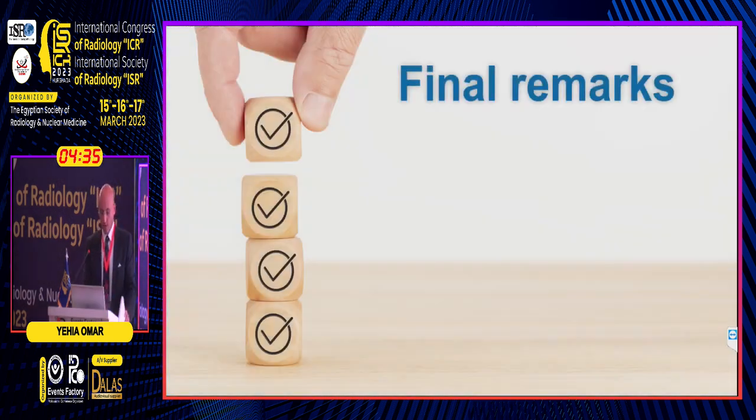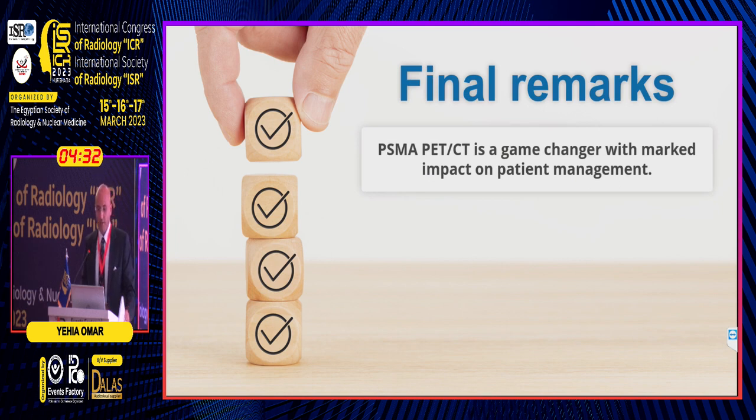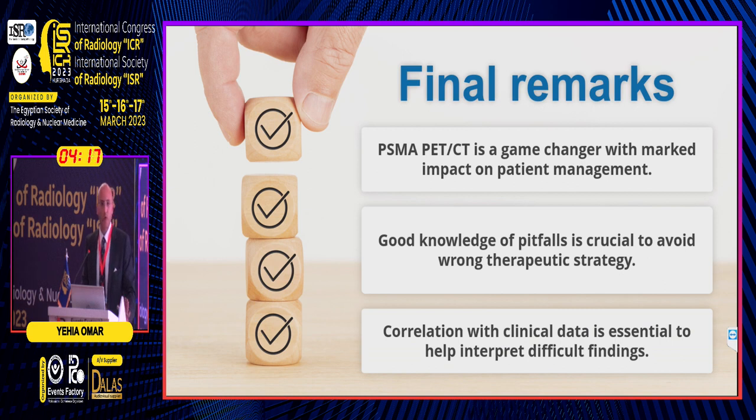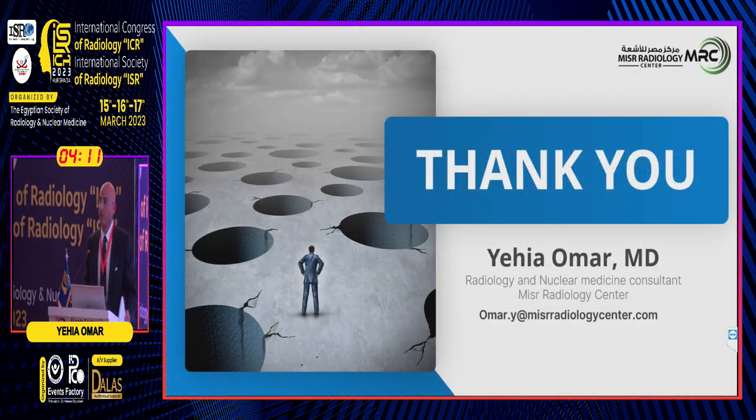So my final remarks, PSMA-PET CT, I believe, is a game changer with marked impact on patient management. And good knowledge of pitfalls is crucial to avoid wrong therapeutic strategy. And finally, correlation with clinical data is essential to help interpret difficult findings. Thank you very much.